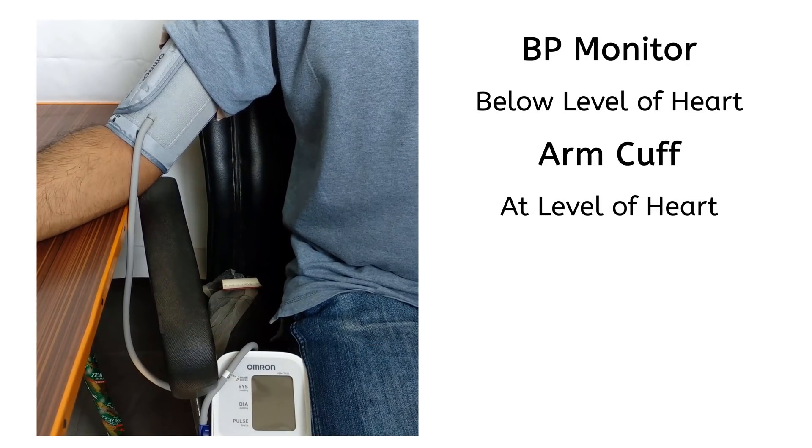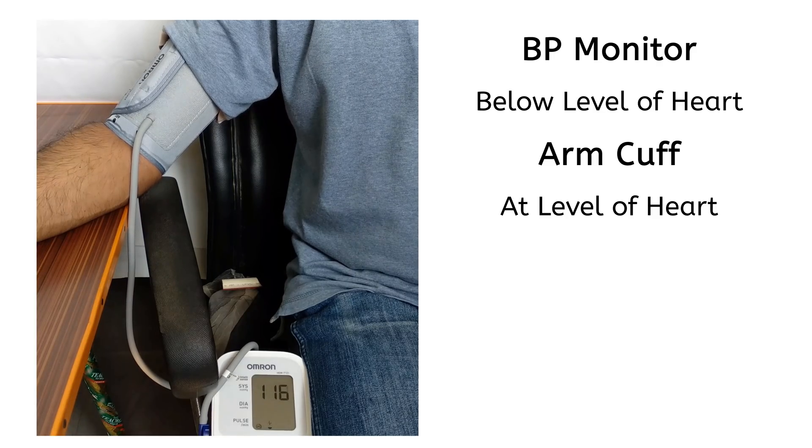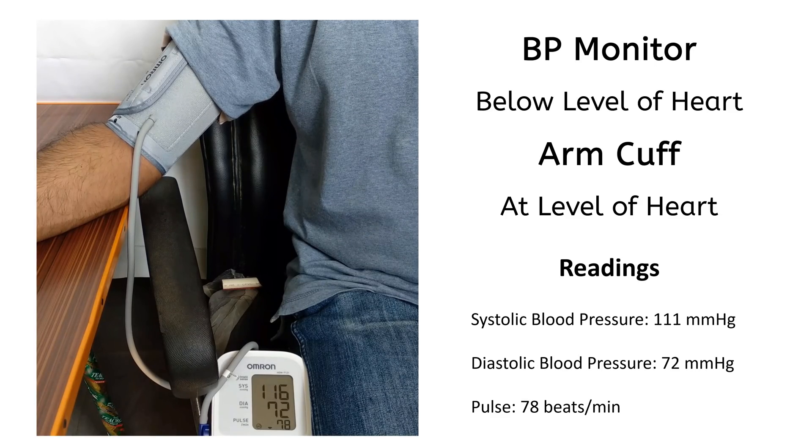This position is with BP monitor below the level of heart and the arm cuff at the level of heart. These are the readings on the monitor.